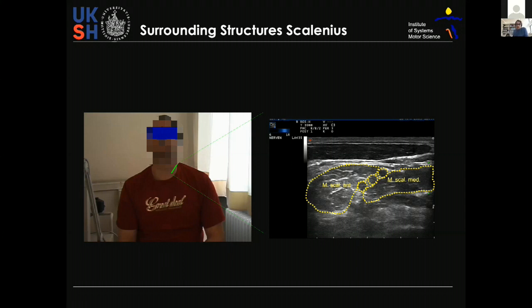Only in rare cases where maybe the omohyoideus is involved, because this is directly under the sternocleidomastoideus. I have some patients where I do this, but not for superficial muscles like the orbicularis oris or zygomaticus. It could be interesting to do so, maybe for analyzing the thickness of the muscle, because the new ultrasound machines become so much better that there could be an approach to do so. But actually, I use ultrasound only for the omohyoideus, which is below the sternocleidomastoideus and directly above the carotid artery. So I think it's impossible to inject the upper part of the omohyoideus without guidance.